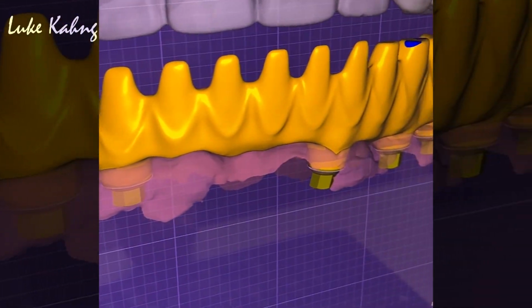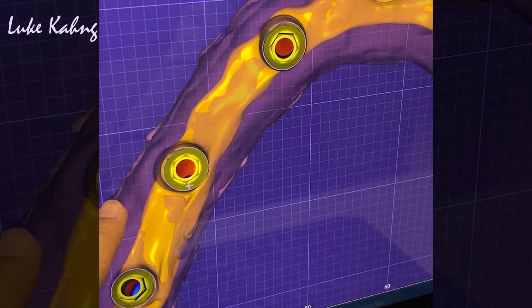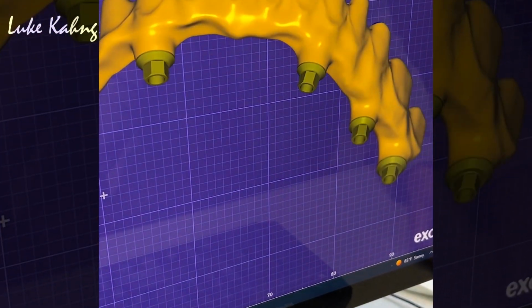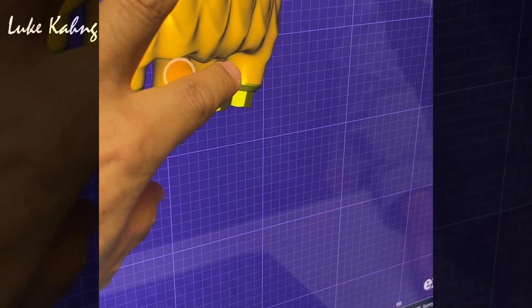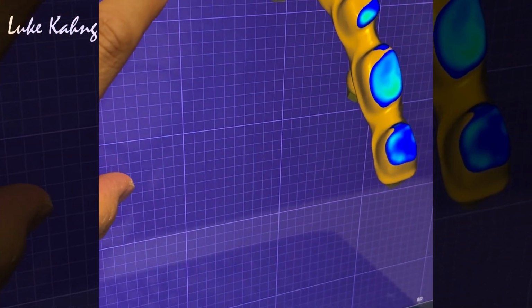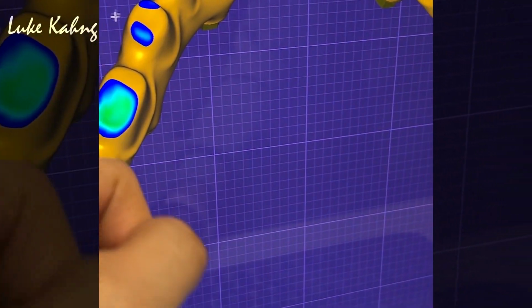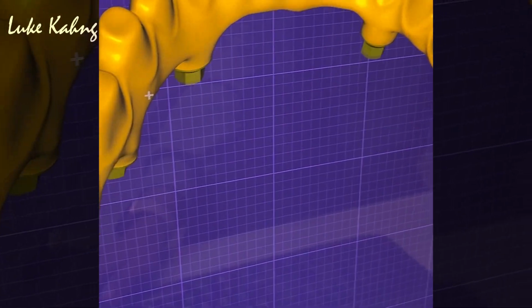Now it's underneath the pontic. We cut that area. So now it's really thin. Alright, so we're going to put some porcelain underneath. I don't like the margin sticking out. That's excellent. Alright. Nice. I don't mind, you can make the posterior a V shape. Then I can make nice occlusion anatomy. Alright, that's good.